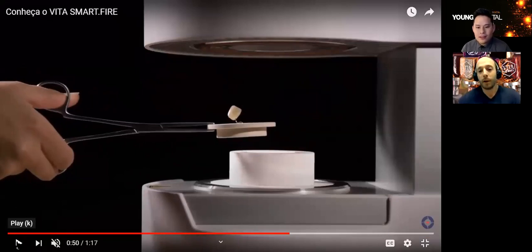One thing that makes this furnace better than other furnaces is this vertical lift. Some other furnaces are a clamshell-type design, but we have far more control over the heat management of the material. If the temperature fluctuates or changes drastically, it can affect the shade of the restoration and even the strength. The diameter of the firing chamber is significantly smaller, which allows us to process glass ceramics like Vita Suprinity and IPS Emax considerably faster. The furnace is made in Germany — they are obsessed about precision.